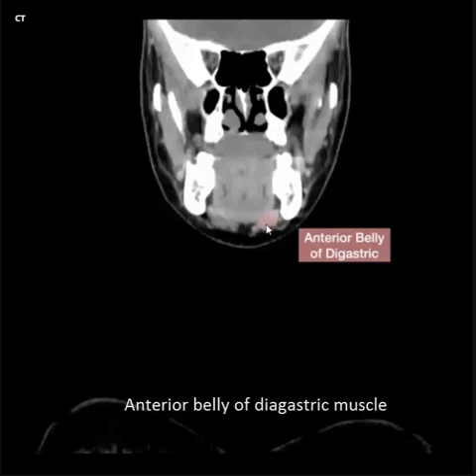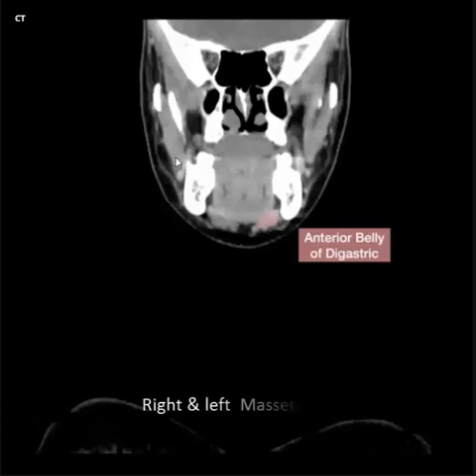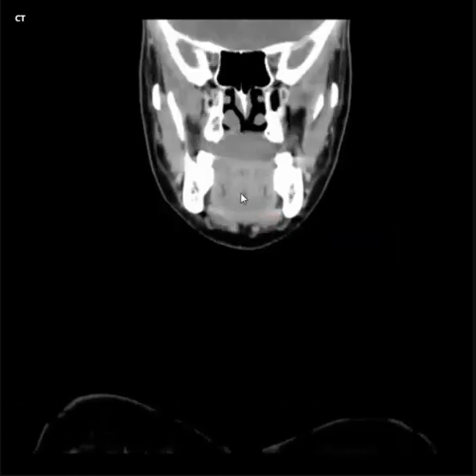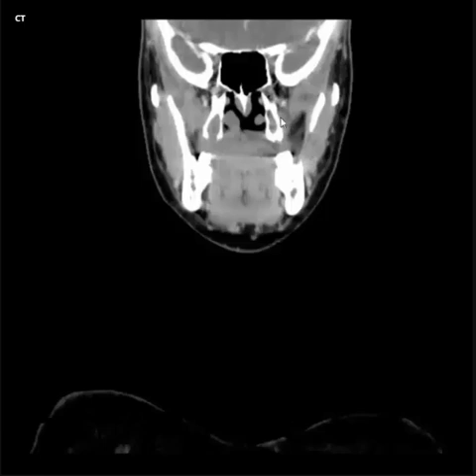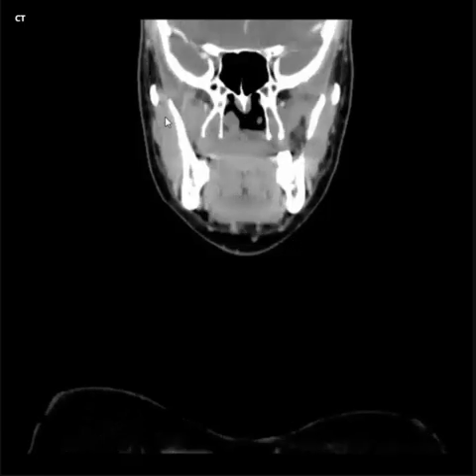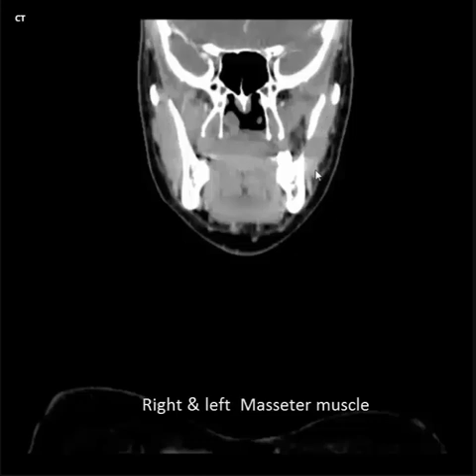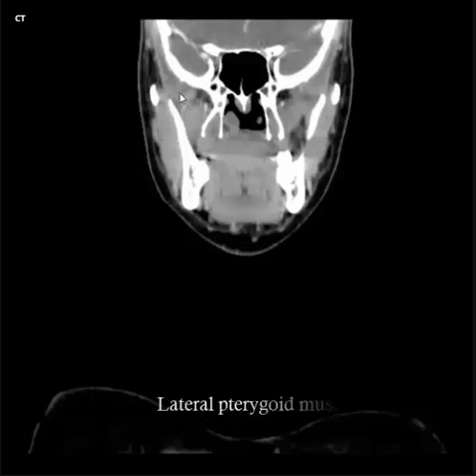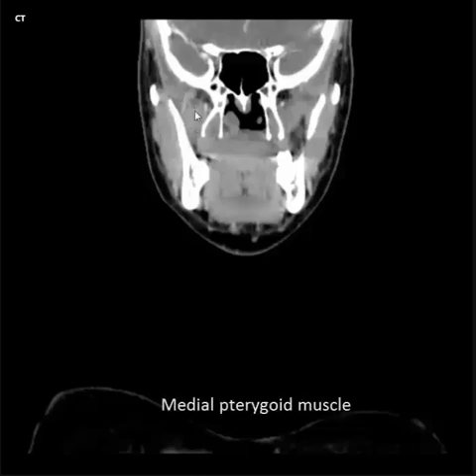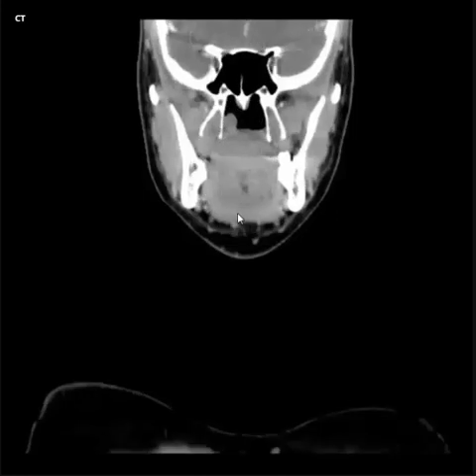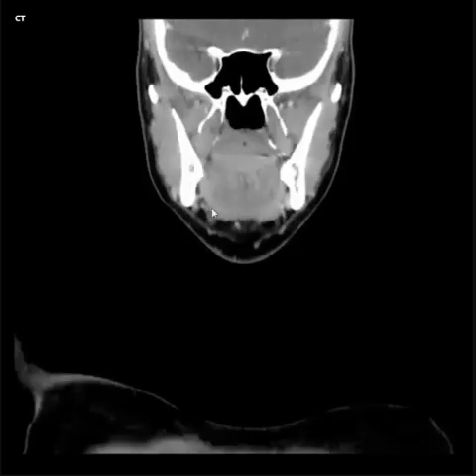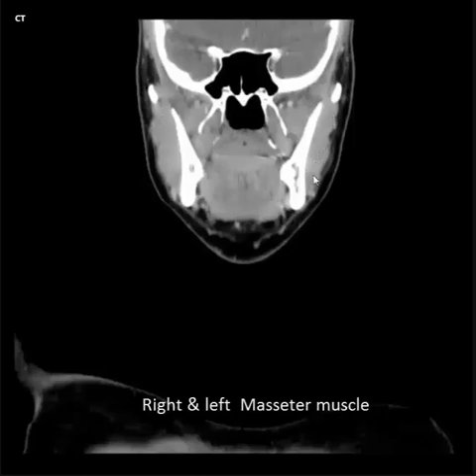Anterior belly of digastric muscle, right and left masseter muscle. Lateral pterygoid muscle, medial pterygoid muscle. Lateral pterygoid plate, medial pterygoid plate. Right and left masseter muscle.